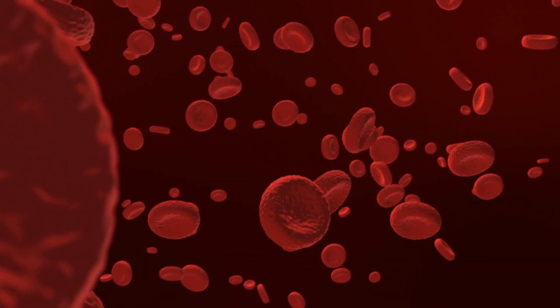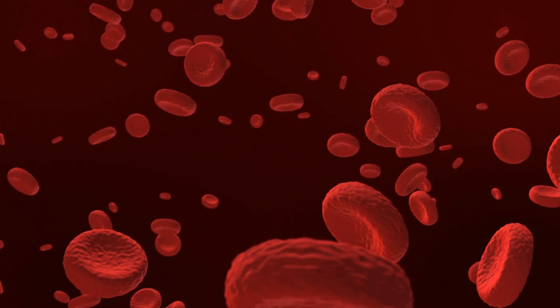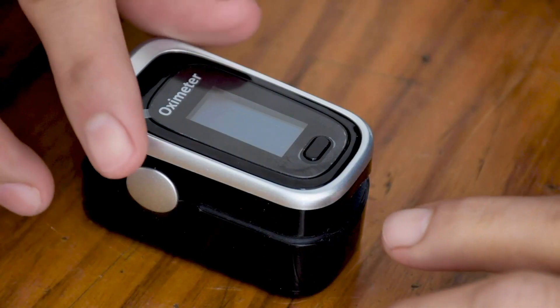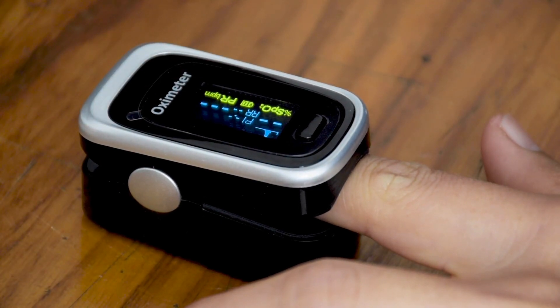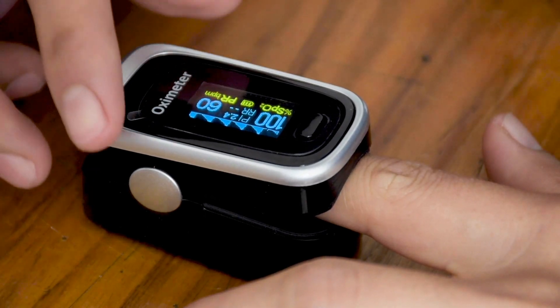Deoxygenated hemoglobin allows more infrared light to pass through and absorbs more red light. The LED lights sequence through their cycle of on and off about 30 times per second, which allows the photodiode to respond to the red and infrared light separately and also adjust for the ambient light baseline. The ratio of the red light measurement to the infrared light measurement is then calculated by the processor, and this ratio is then converted to peripheral oxygen saturation.